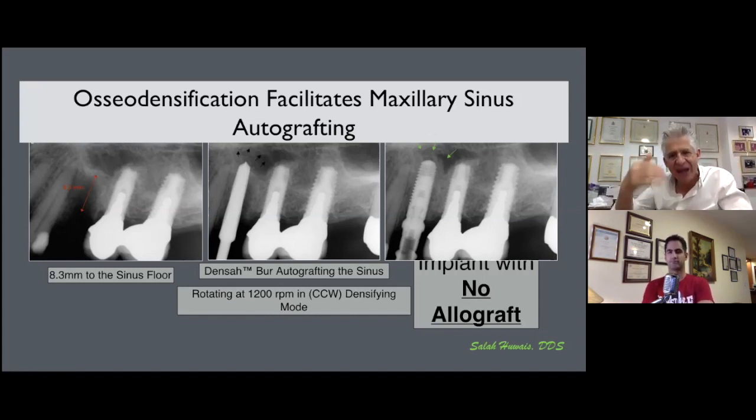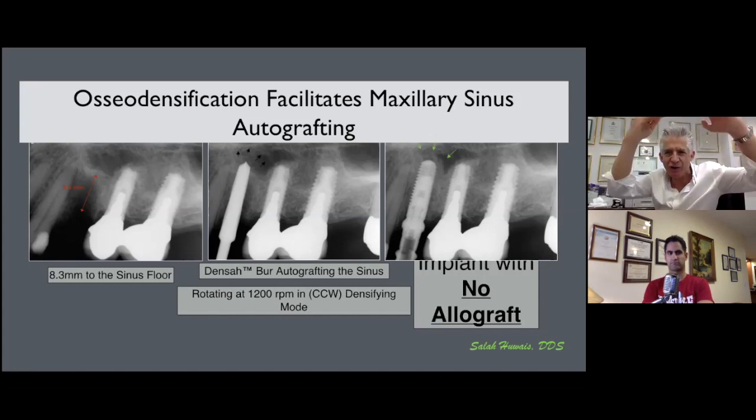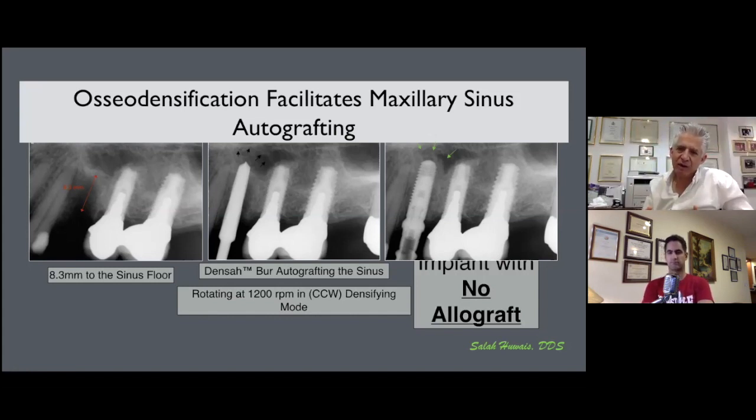It means you've now milled into little particles the floor of the sinus, and now you have moved everything upwards, and you can go on to your next drill. So there is an acquired feeling for this, and as soon as you start using these drills, you will feel that resistance, that vibrating noise.